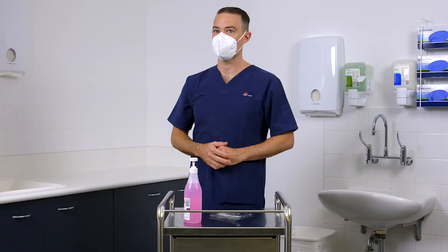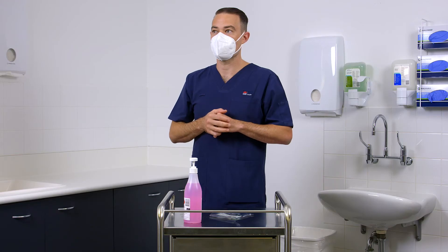Inhale and exhale sharply. If air leaks around the nose, readjust the nose clip to eliminate leakage by repeating earlier steps. If air leaks at respirator edges, adjust the loops behind your ears.